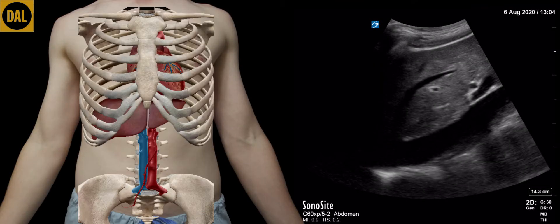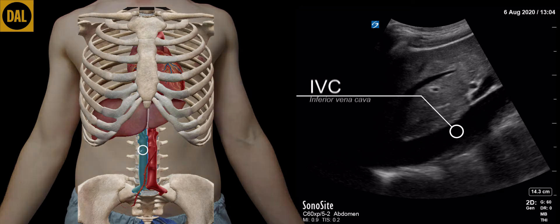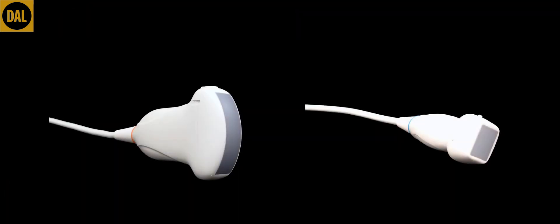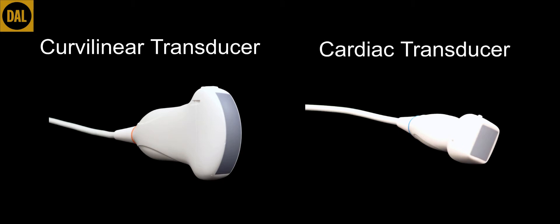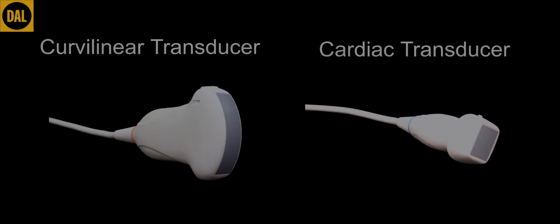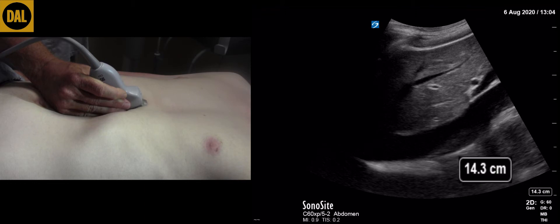In this video we will be doing a scan of the inferior vena cava. For this scan we will be using the low frequency curvilinear transducer. Alternatively, the cardiac phased array transducer can also be used. The initial depth should be set appropriate to patient body habitus. Larger patients will require maximum depth. In this case we are using a depth of 14 centimeters.